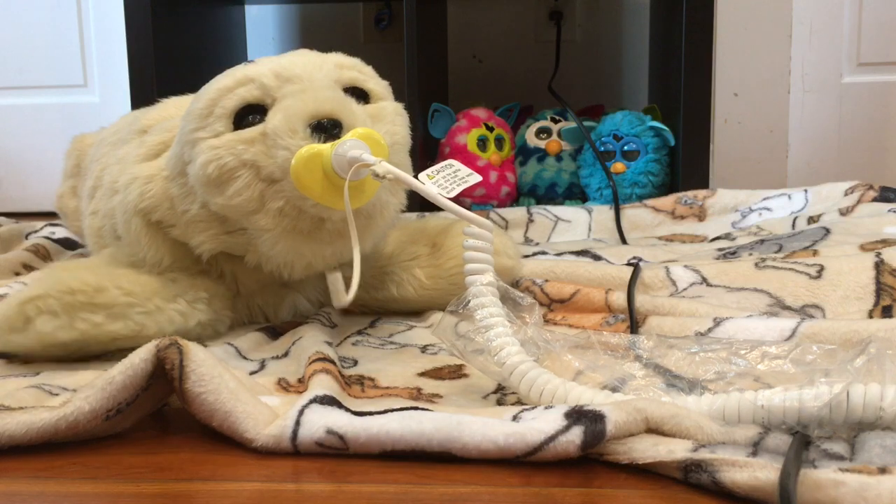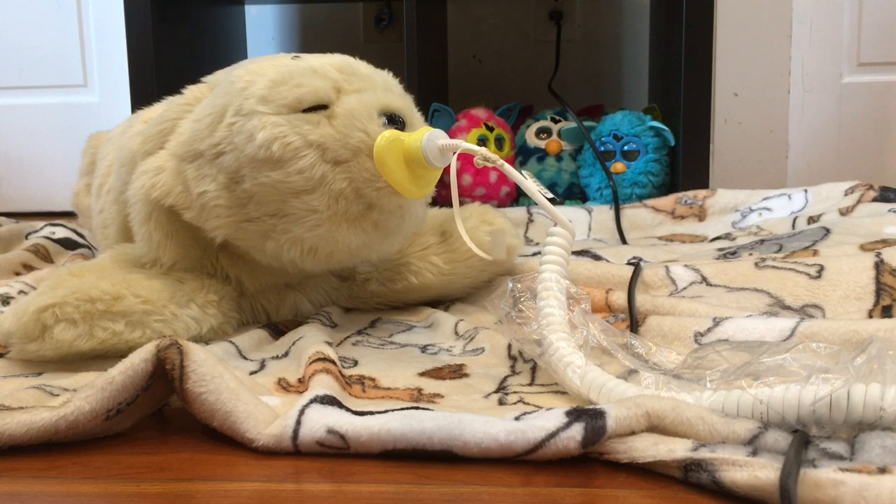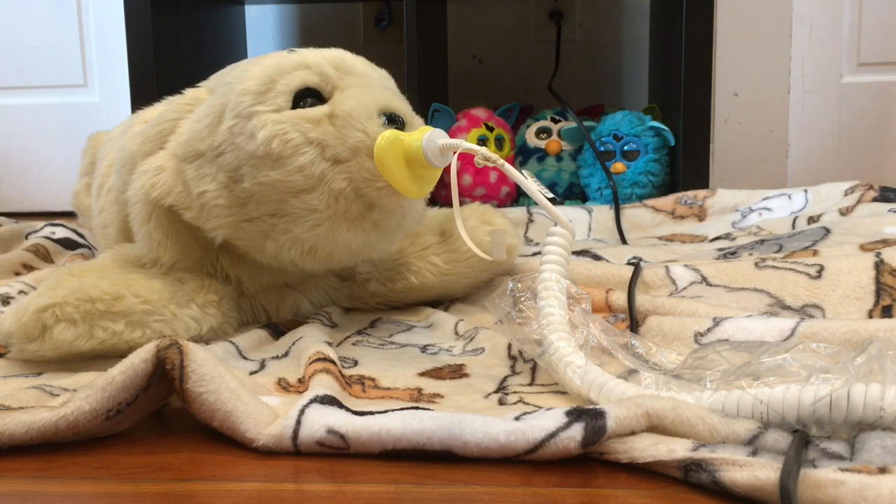PARO does not move his mouth at all. The mouth there only serves a purpose as being the plug for the charger.